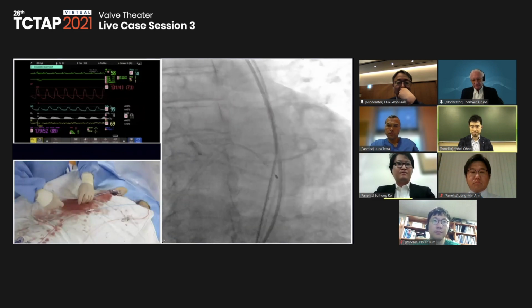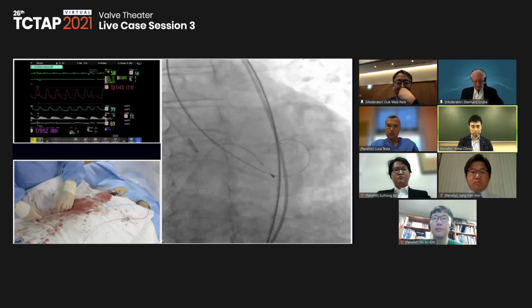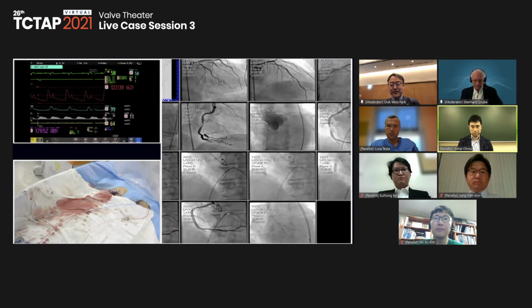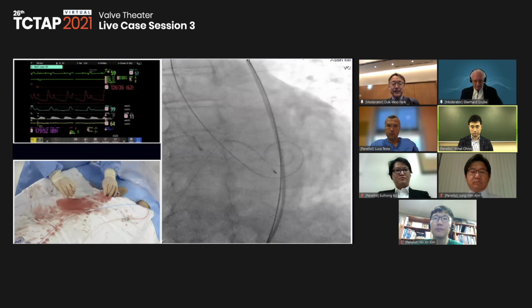Thank you. In such a case, we do decide on predilation. The detailed criterion for predilation is a calcification amount of more than 500 cubic millimeters. In such a case, we predilate, and if less than 500 cubic millimeters, we do not do predilation, just direct stenting.